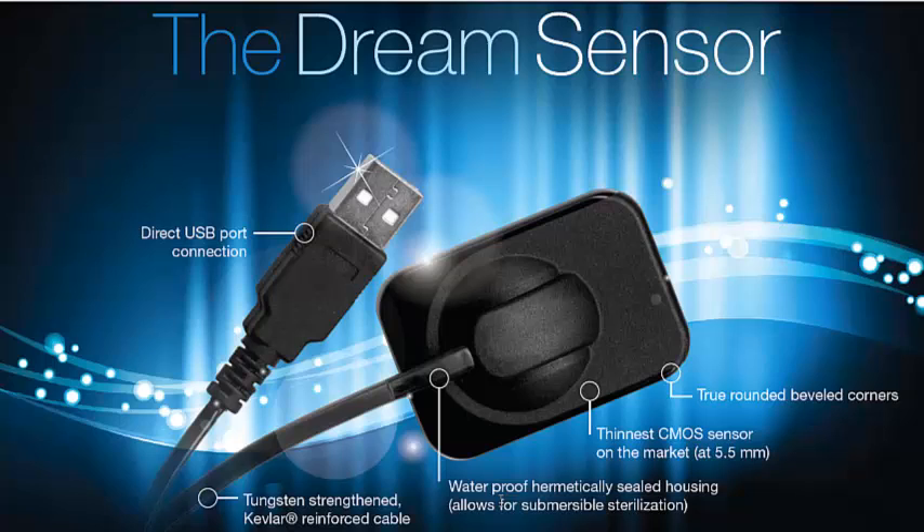The sensor is waterproof. A lot of sensors aren't — ours is. It has a medically sealed housing on the sensor, so it's completely submersible.